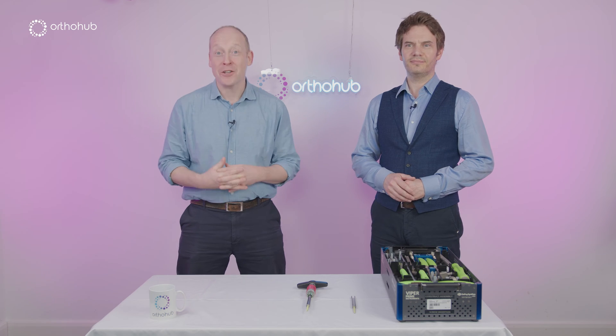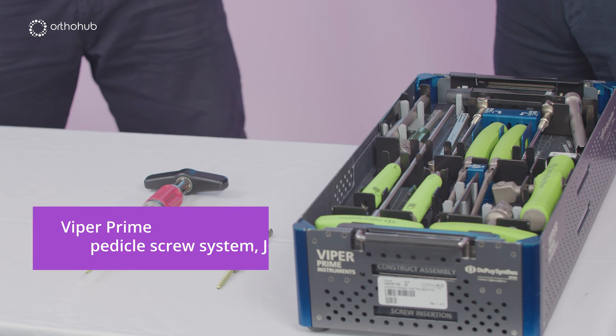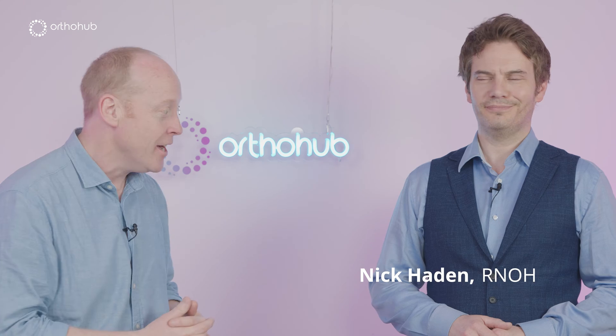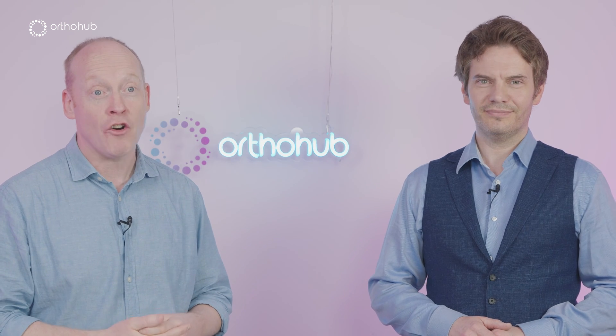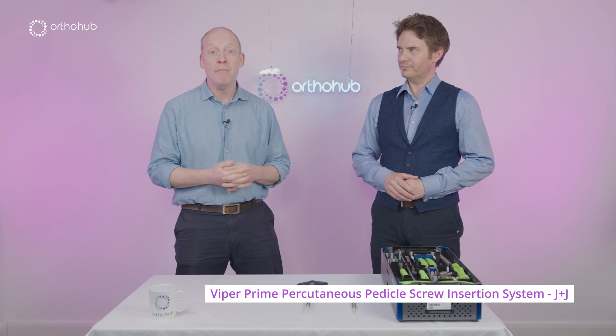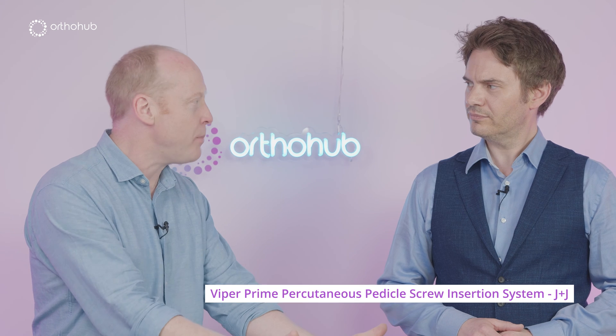Welcome to this, the first of our OrthoHub unbox videos, where we take a kit, a surgical kit, and an expert, and we pull it all out and see how it works. Today I've got Nick Hayden, a spine surgeon at RNOH Stanmore, and we're talking about the Viper Prime minimally invasive pedicle screw insertion kit. Nick, why have you picked this for us today?